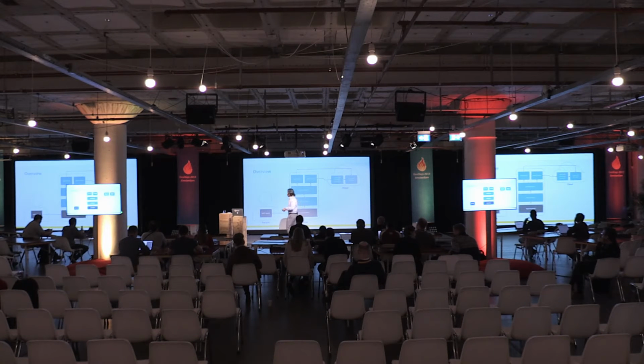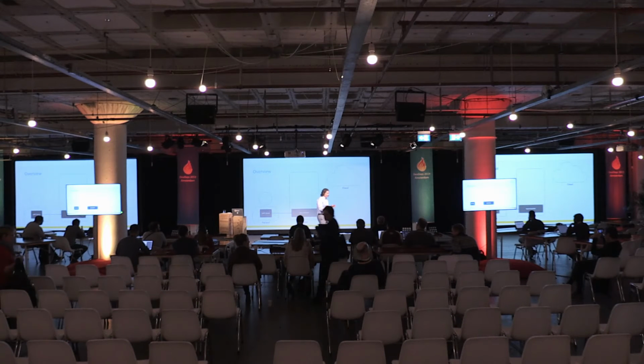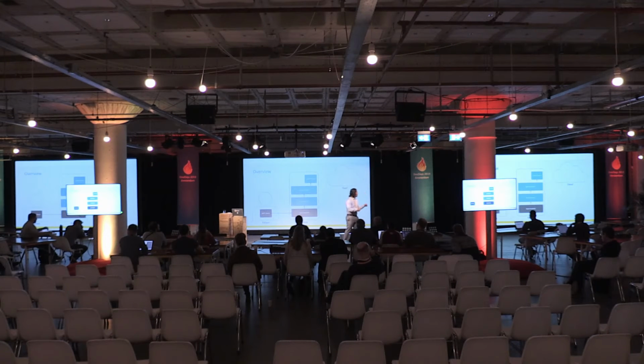Okay, so the overview. In a real life scenario, you would have this IoMT device, so a patient would be wearing a wearable or using a scale or a thermometer, and this data is flowing into HealthKit. So the HealthKit on FHIR Swift framework, when it sees this new data come in, is going to do a query on HealthKit, take the data, and then pipe it through the IoMT FHIR connector for Azure, which then transforms it into FHIR resources and saves it into the FHIR server.